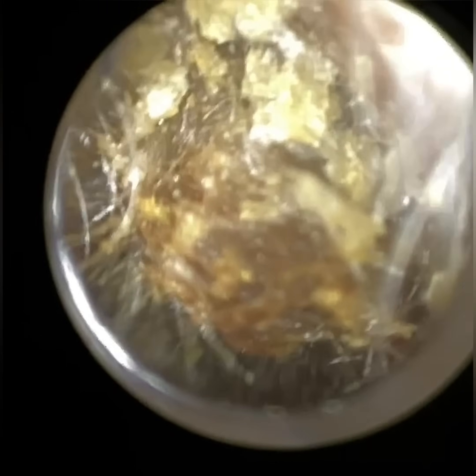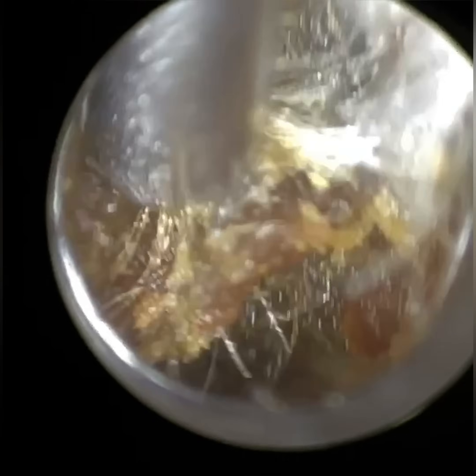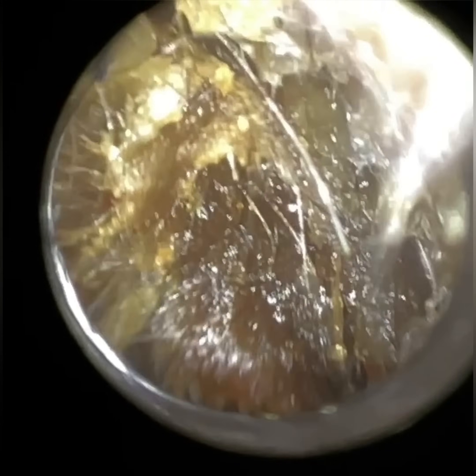I've managed to remove the more lateral wax and dead skin, so we're now more halfway into the ear canal. I'm just readjusting the focus. This wax has really, really impacted. I had to use an earhook in the end to remove the final section of the wax — you will see that. In fact, their right ear was even more blocked. We're in the last third of the ear canal now, so again I'm just adjusting the focus.